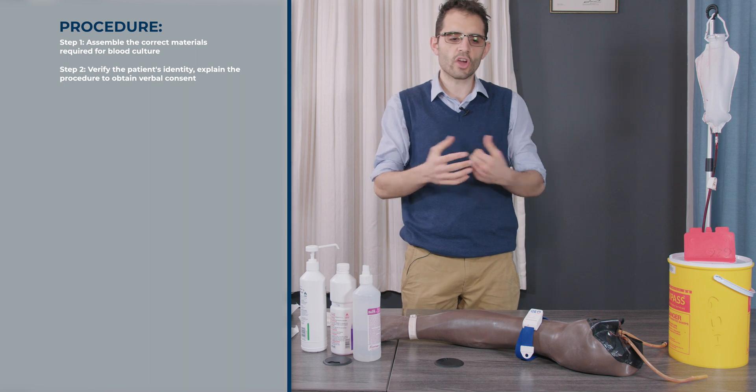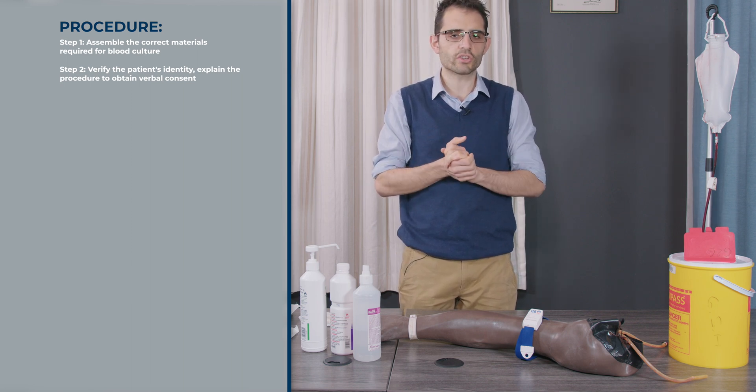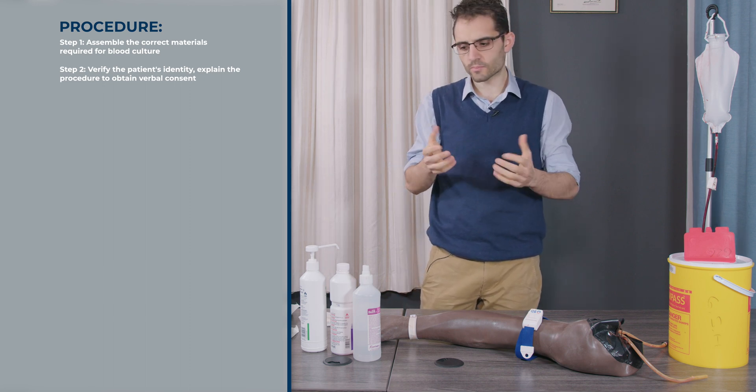You need to go and identify yourself to the patient, introduce yourself, and tell them what you're going to be doing. Make sure that you're taking blood on the correct patient. Once you have done that, you can start preparing your table.